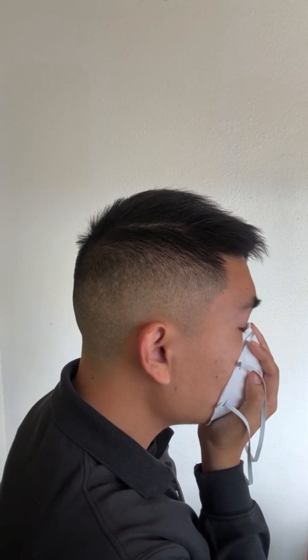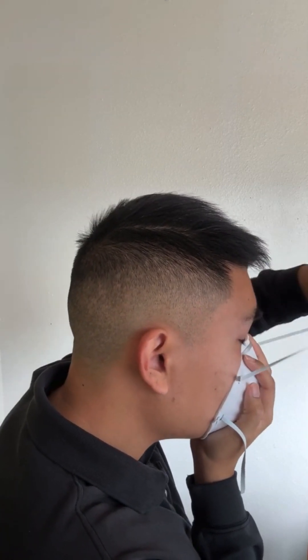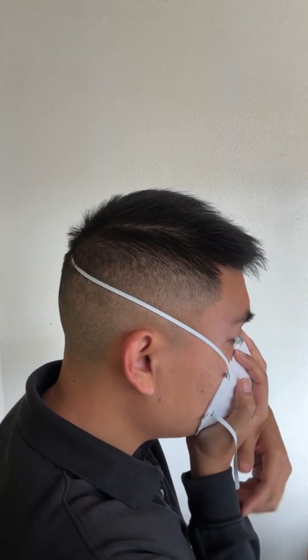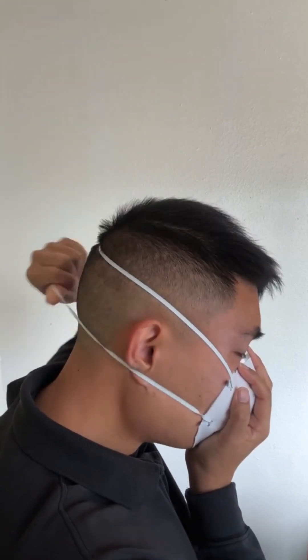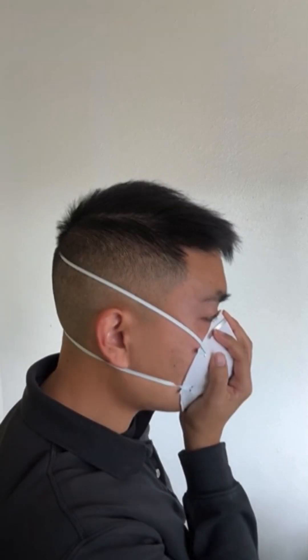Place the respirator into the palm of your hand, making sure both elastic straps are not tangled together or twisted. Put the mask on with your chin resting snugly into the bottom of the mask. Pull the top strap over the head first, then pull the second strap over the head to have it rest below the ears. Make sure to not crisscross the straps.